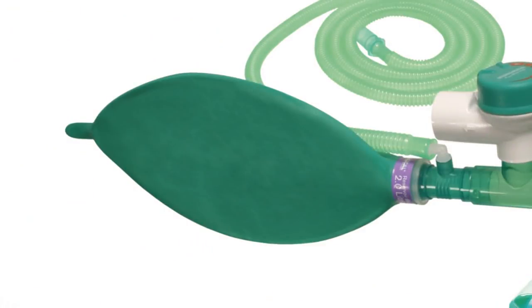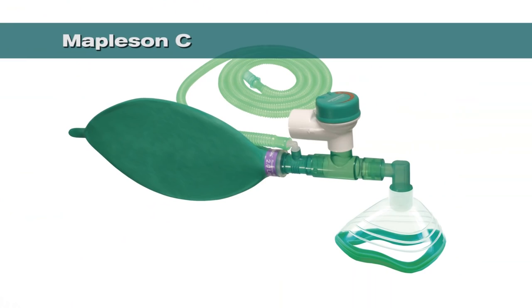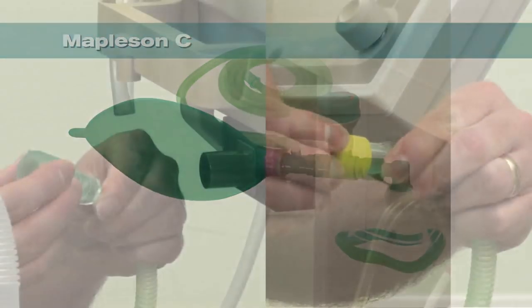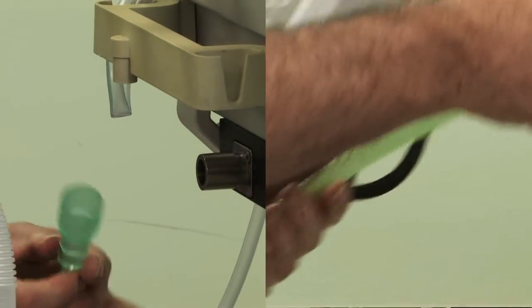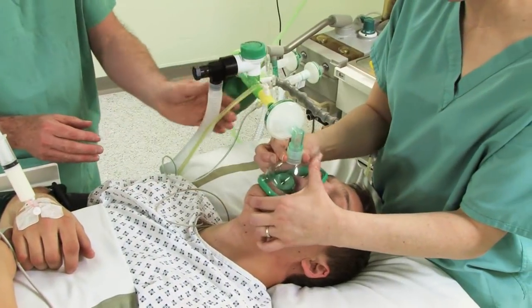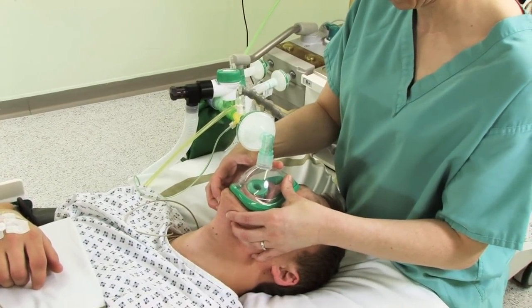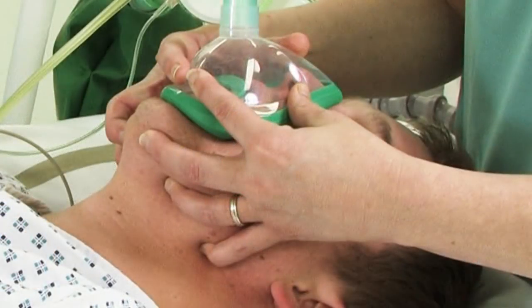In order to manually ventilate a patient, an anaesthetic breathing system such as the Mapleson C can be utilised. Connected to an oxygen supply at the fresh gas outlet, a correctly fitting face mask is placed over the patient's face in order to obtain a tight seal. This can be achieved by hooking the 5th finger at the angle of the jaw, holding the mandibular body with the 3rd and 4th fingers and holding the mask between the index finger and thumb at the position of the angle mount.